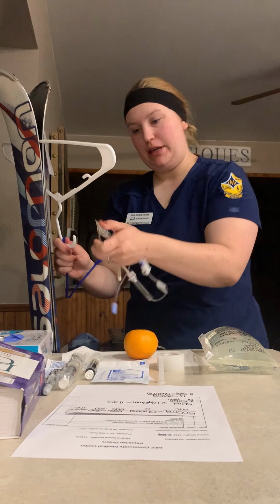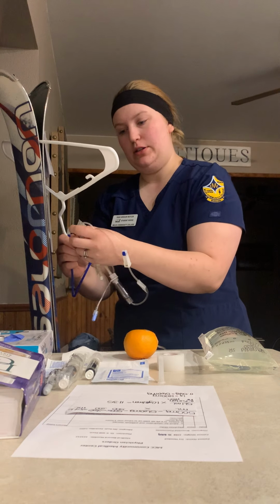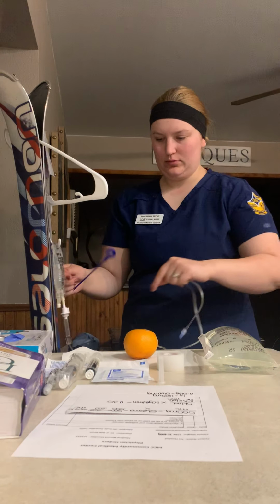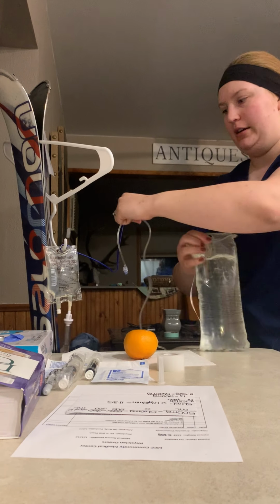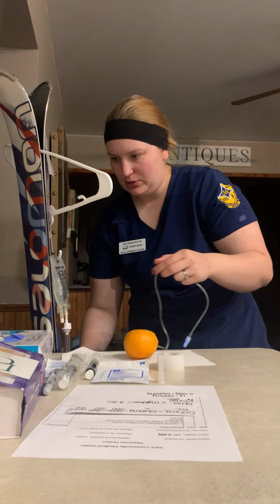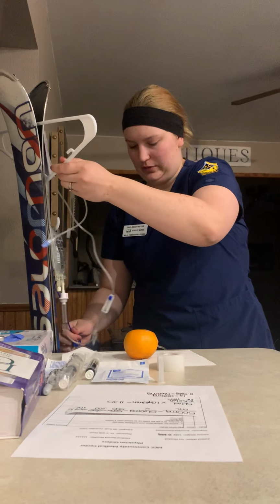So you would hang your piggyback on top, and then your larger bag would go below. And I apologize, mine is really low. Yeah, it's gonna fall down.